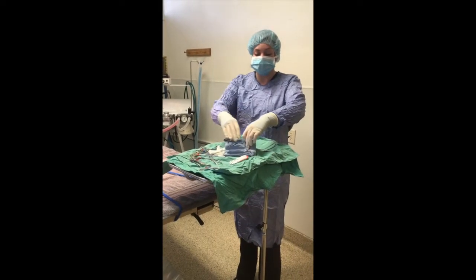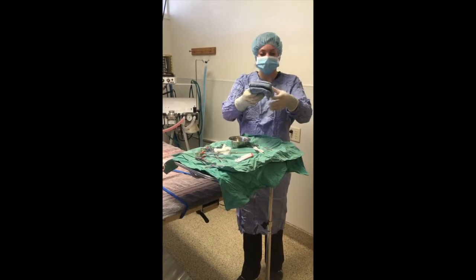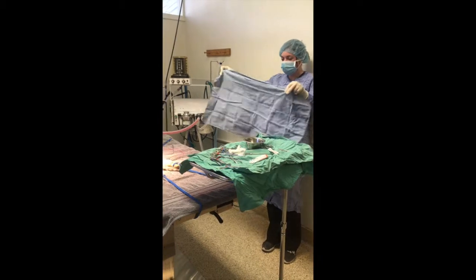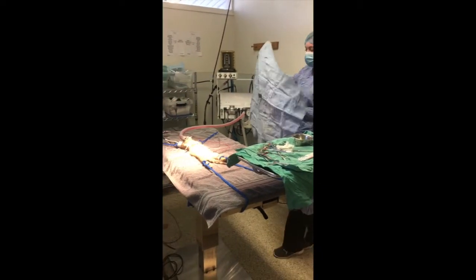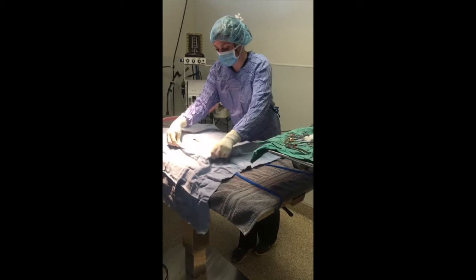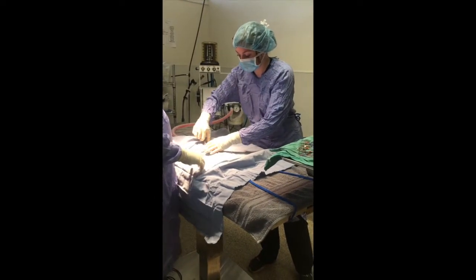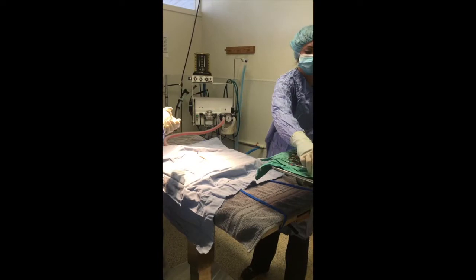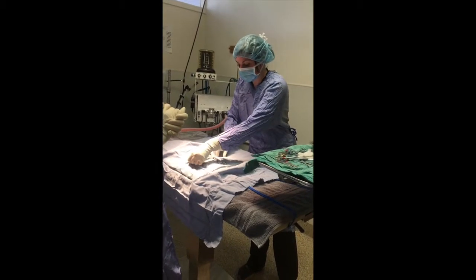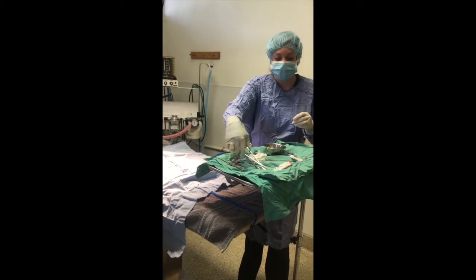Alright, so I'm going to go ahead and demonstrate draping the cat. So our pack is sterile. Where the doctor is going to make this incision, I'm going to go ahead and clamp it in place. Alright, we now have the drape in place. Now I'm going to go ahead and attach my blade to the scalpel handle.